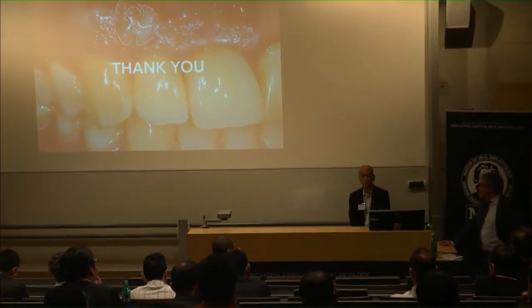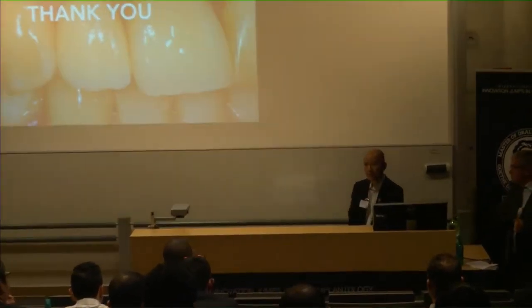Basically, we try to preserve whatever nature gives, so we don't touch that portion. We have known for a long time that if we touch that connective tissue attachment, we will have biologic width impingement. That will cause inflammation and recession. Now, there is another school that suggests to cut the shield to the bone level. And I observe many of them.